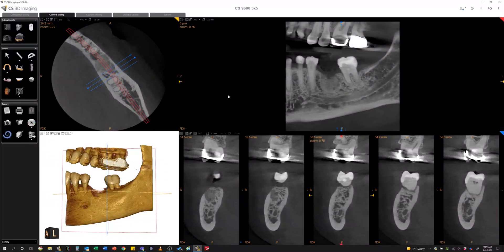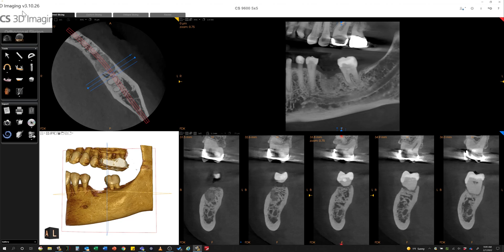Hey, so this is Dan with CareStream Dental. I'm going to show you a new tool that I learned about that is available, and really back by popular demand. It's something that was available in the CareStream Dental 3D viewing software in earlier versions, and CareStream Dental brought it back in the latest version — version 3.10.26.